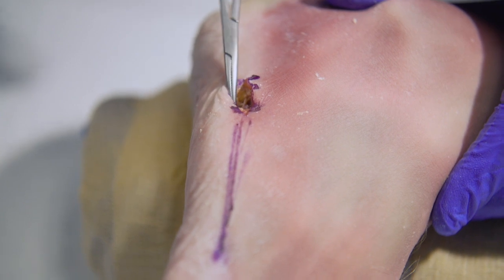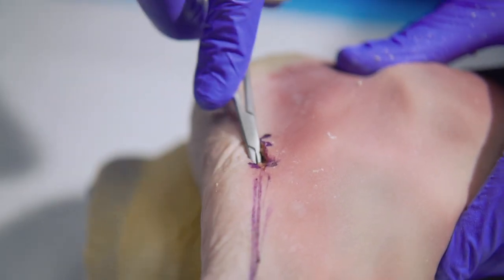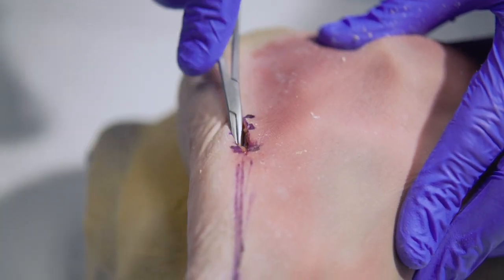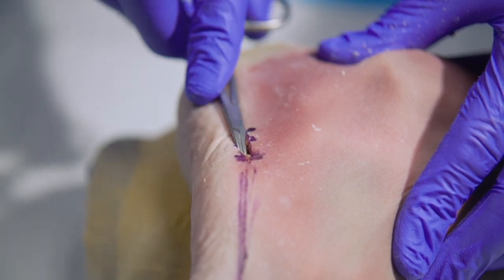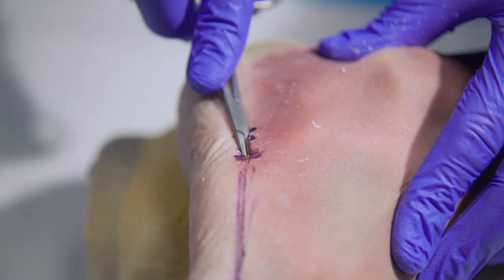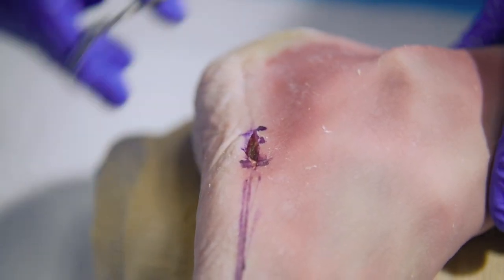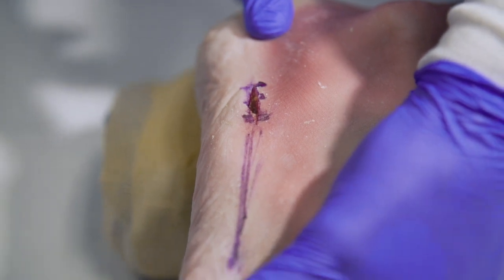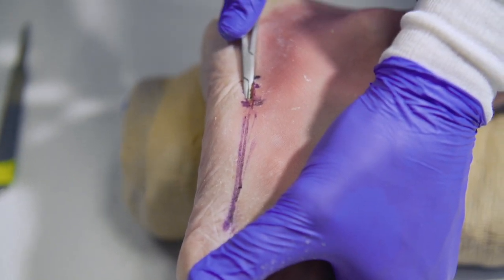So after our controlled depth incision, we can take a hemostat to bluntly dissect down to the level of the fifth metatarsal base. Then you can use the mosquito as an extension of your finger to feel where that starting point will be. Utilizing a bump underneath the heel allows you to lever open the metatarsal cuboid joint, which makes your starting point with the guide wire a bit easier.